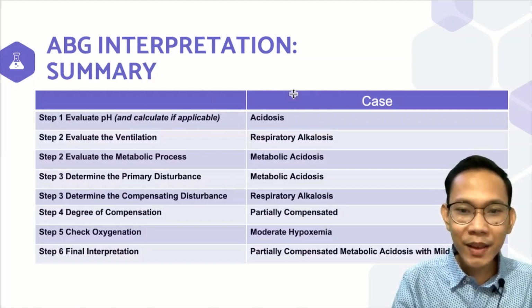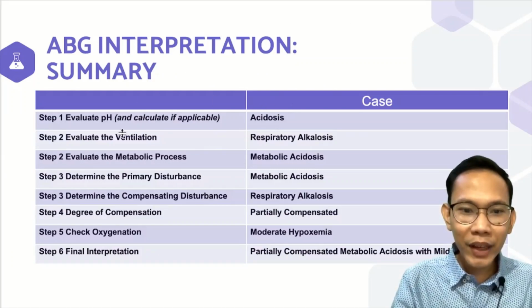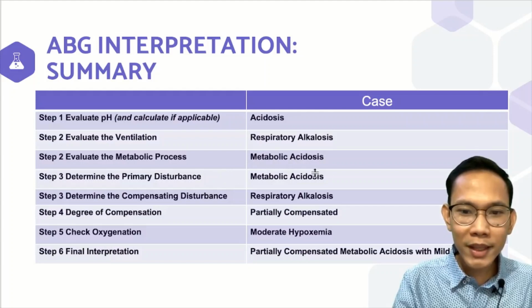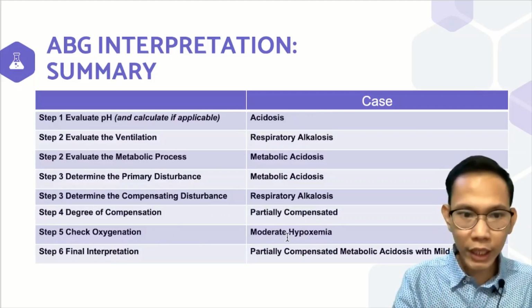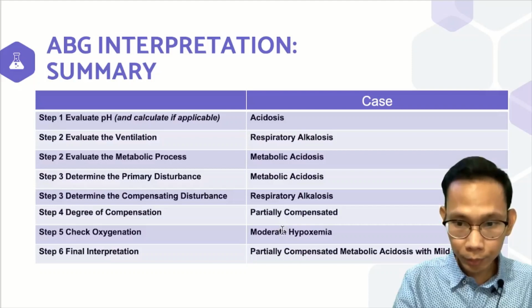Sa ating case, acidosis, evaluate ventilation, respiratory alkalosis, metabolic process, metabolic acidosis, primary disturbance, metabolic acidosis, compensating, respiratory, compensation partially, oxygenation moderate, this is mild, this is mild.